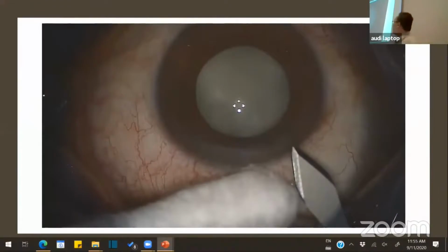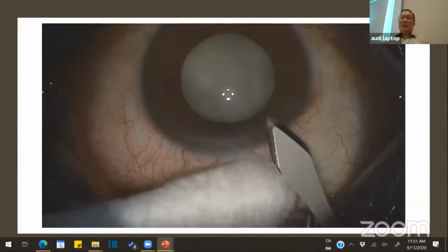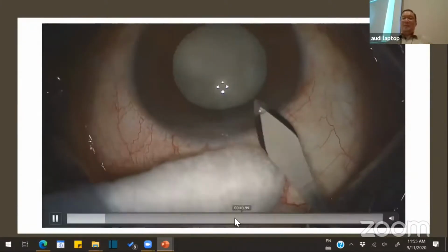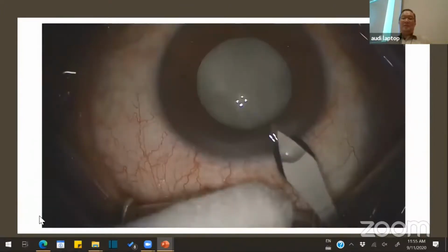Okay, this is interesting. Done by one of my trainees. Okay, look at it. Main wound. Look at it properly. Pressing. Can you see it's pressing the wound? Okay, gush of fluid come out. Probably repeat.